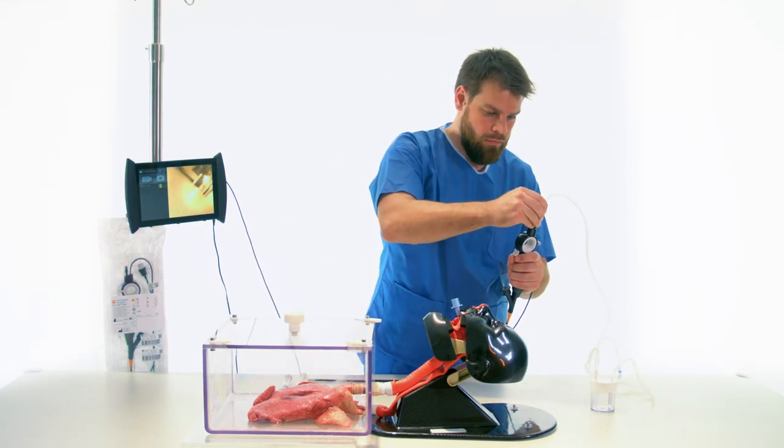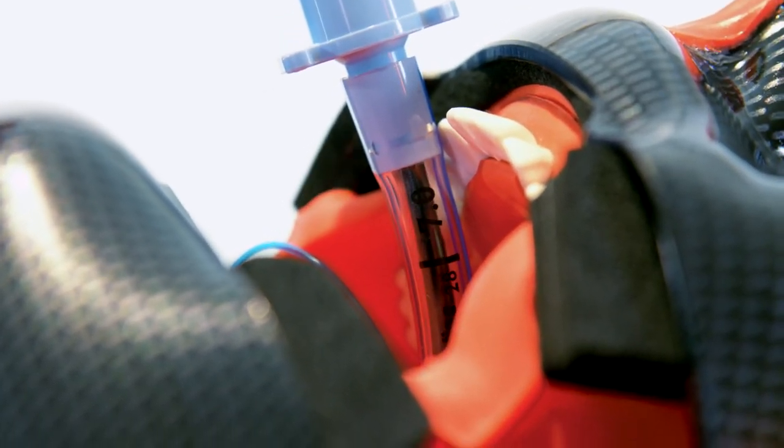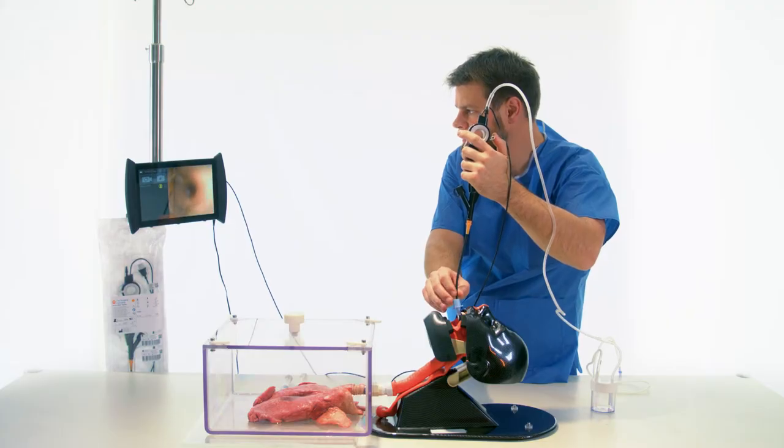The procedure can be performed in awake patients or in a sedated and ventilated patient in the intensive care unit.